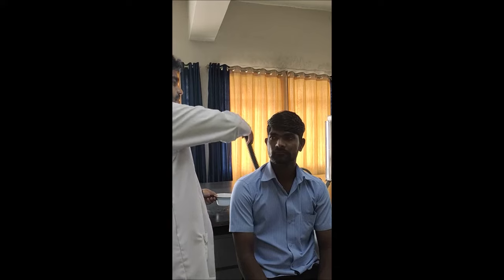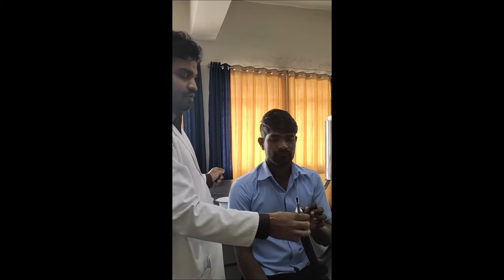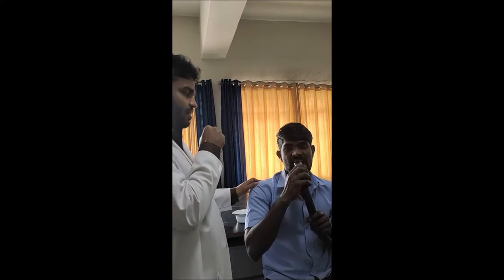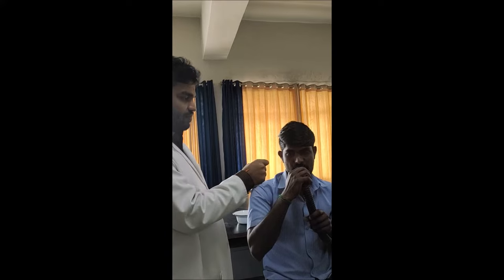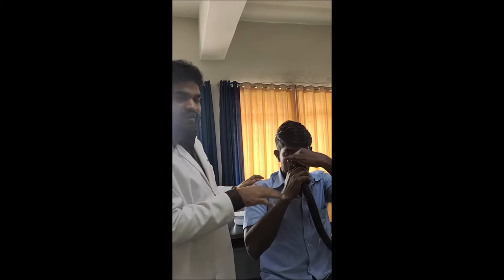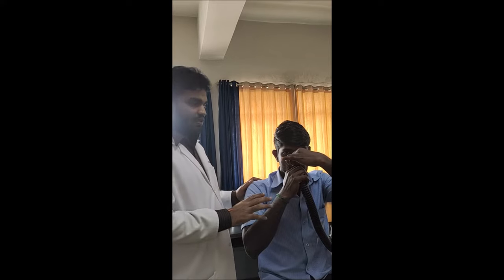Now we are going to record the spirometry reading. There is an aseptic solution — rinse the mouthpiece thoroughly and give proper instructions to the subject. After rinsing the mouthpiece with aseptic solution, I am going to give instructions: keep the mouthpiece in the mouth, close it, and close the nose. This is the way you have to perform it. Okay, relax now.